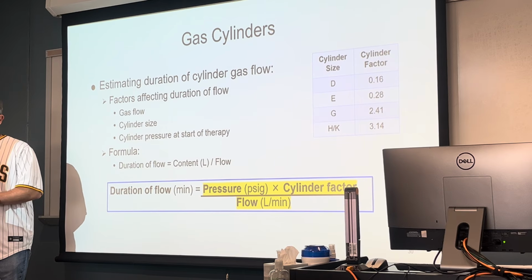So you always have to account for that. Don't leave it right up to that second, because what if there's a train? What if there's traffic? What if something prevents you from getting back in the time you thought? So, things we need to know. It's important. How long is this thing going to last our patient?